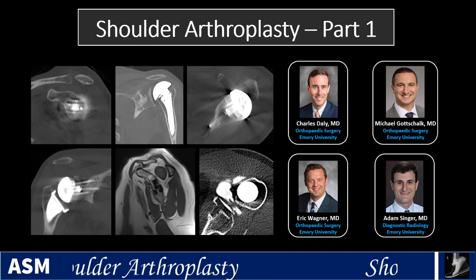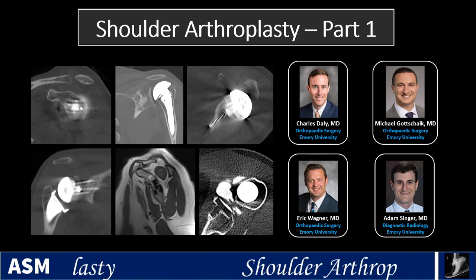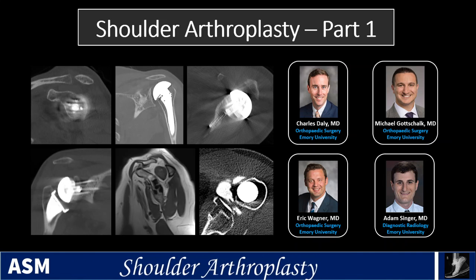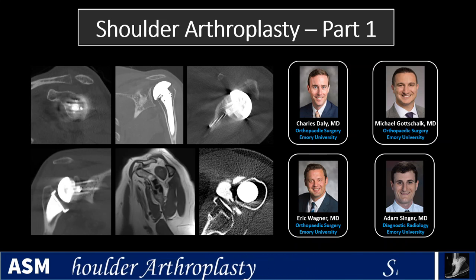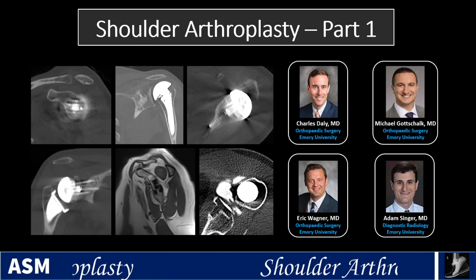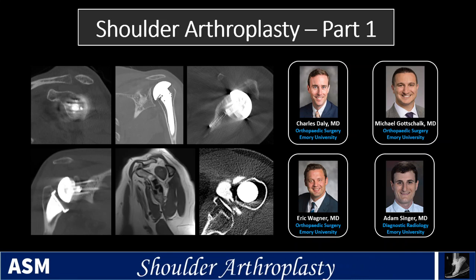Arthroplasties. This will be part one of a series where I'll begin talking about the background about shoulder arthroplasties and go through some of the radiology information. And part two will be a discussion with my orthopedic colleagues, Dr. Charles Daly, Dr. Michael Gottschalk, and Dr. Eric Wagner. I want to thank them for providing some of the images for the part one presentation.